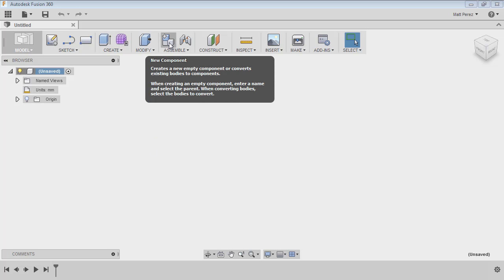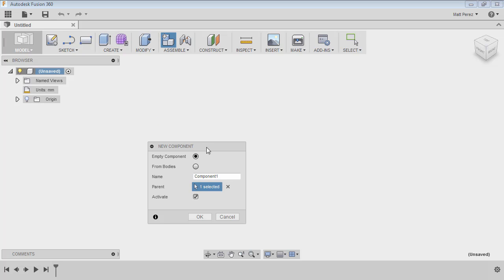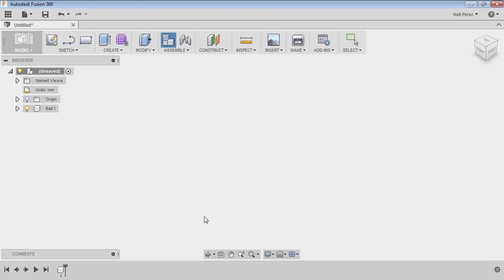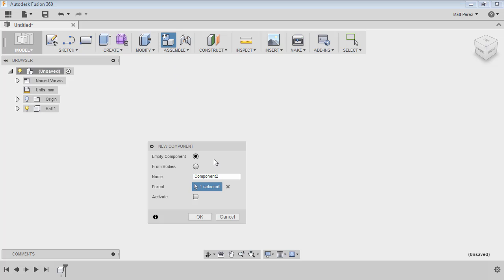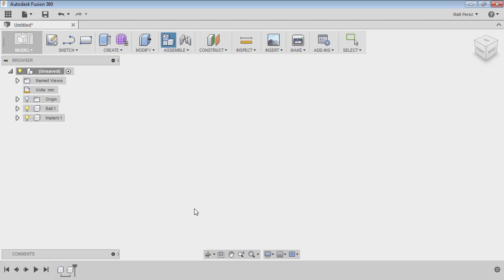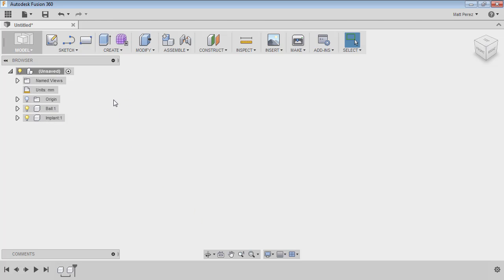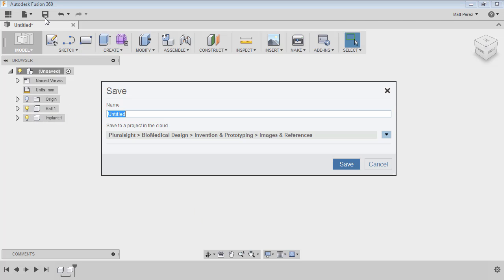From the assemble tab, we're going to use new component. And we're going to name the first one 'ball'. We're going to deselect the activate option and say okay. And then we're going to create one more. We're going to call this one 'implant'. You'll notice that it remembered our last setting and it's not going to activate this one. So now we have the overall unsaved, we have the ball, and we have the implant. Now, before I do anything else, I'm going to save this file.